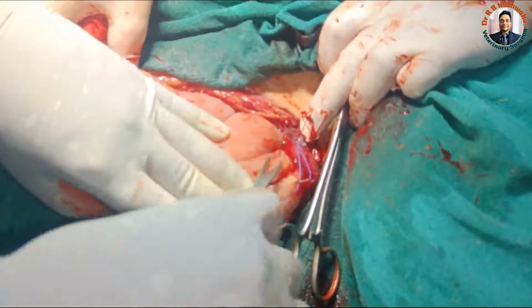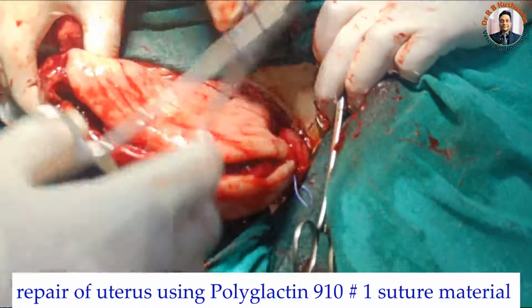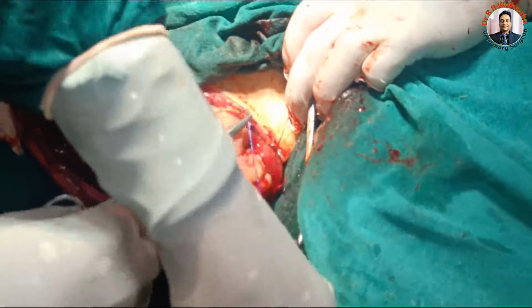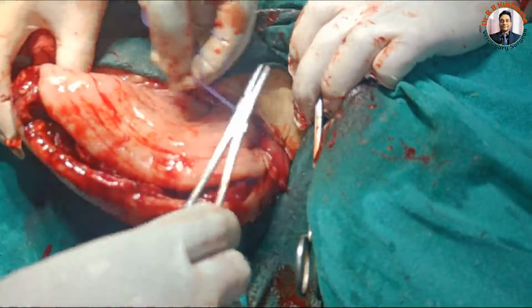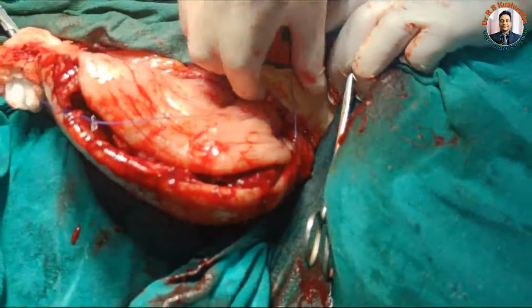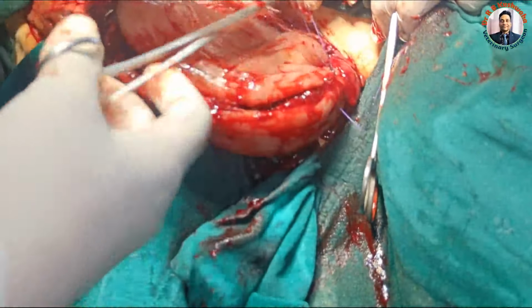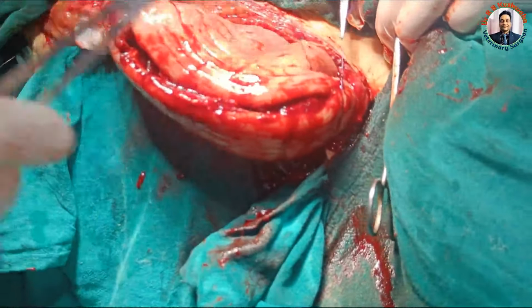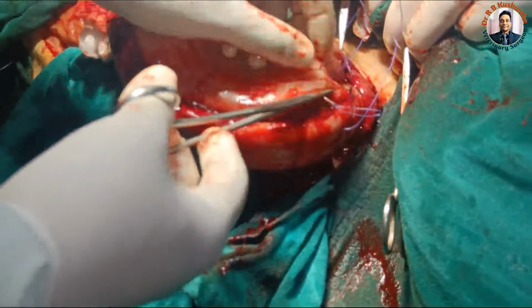So we repair this uterus in 2 layers. The first layer we repair with the Lambert, followed by the second layer, Cushing. Hold this one. In the Lambert, the bite is taken at right angle to the incision site, including only up to the submucosa, not the mucosa.